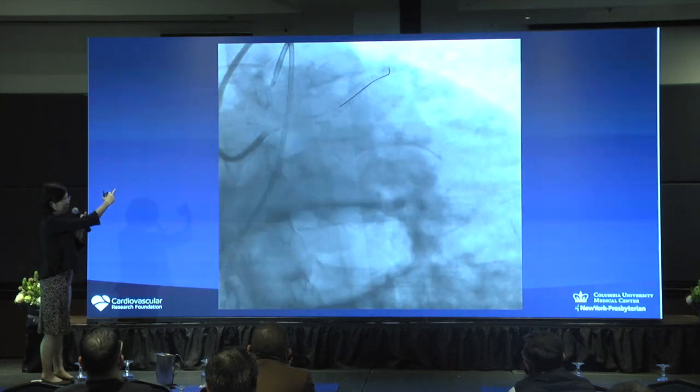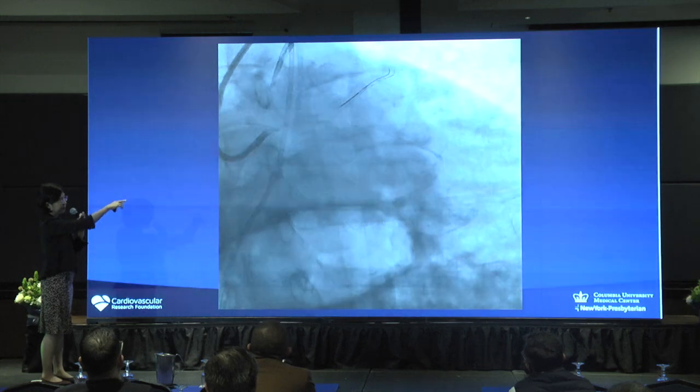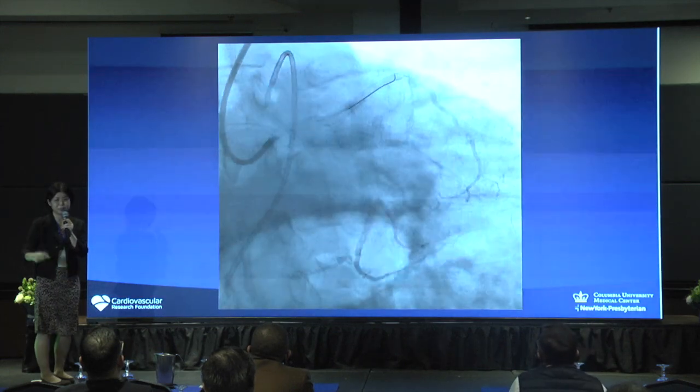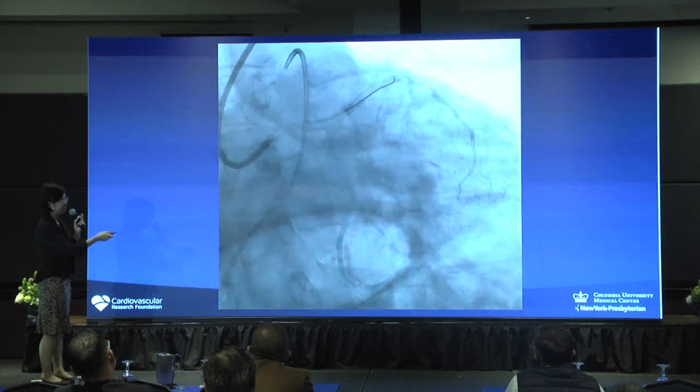You see the left main, distal left main, same size, and much bigger compared to the circ and the LAD. This is a correct picture. Remember how it looks before. It's very small diffuse disease in the distal left main. So that kind of common sense is very important.